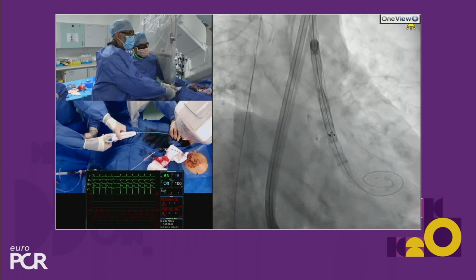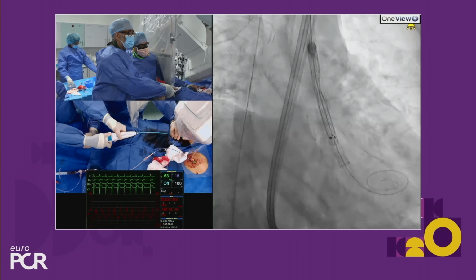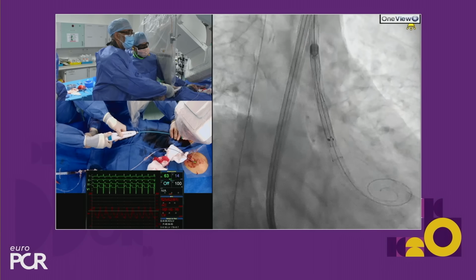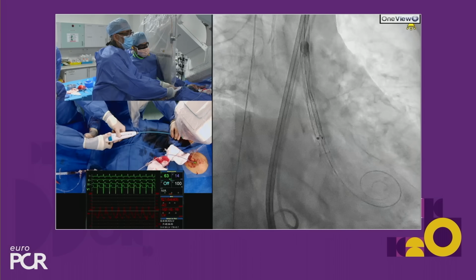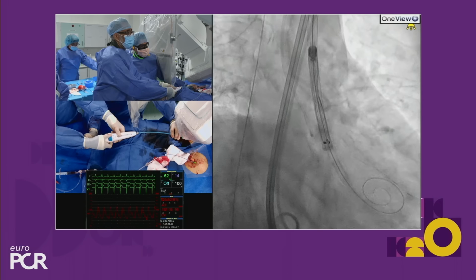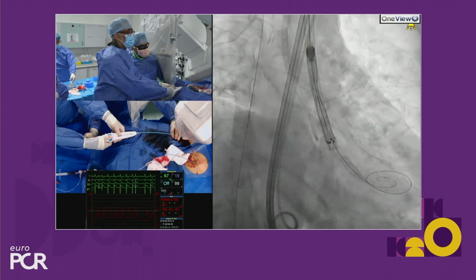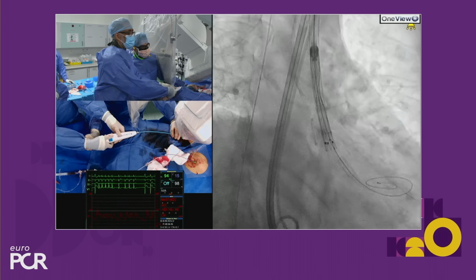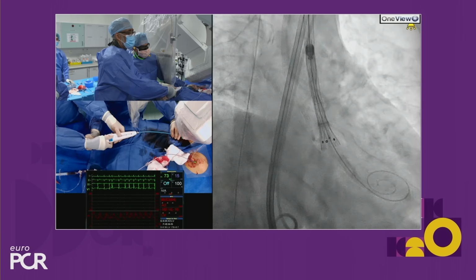So we're going to watch the hemodynamics. There's already left bundle branch block. And I'm deploying while Neil is controlling the valve position. The pigtail's not really moving, which is great. I'll just push that down a tiny bit to lock it down there. And the dots are remaining where that calcium is, which is great. Here it comes. So it's drifting downwards, isn't it? Yeah, it's fine. It's just moving a bit, so it's going to capture a bit. So that's looking very nice. That height is looking on the money.